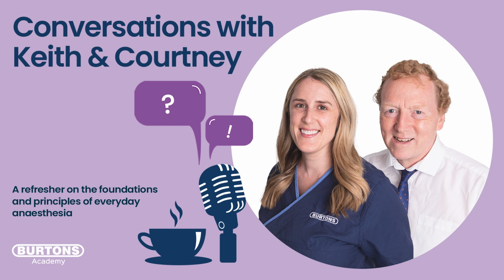So putting in a tidal volume of 200, reaching a pressure of 12 centimeters of water. And then when you decide you want to ventilate at 12 centimeters of water, you see that you get a volume of 200, and you're like, oh, it all makes sense. That's right.